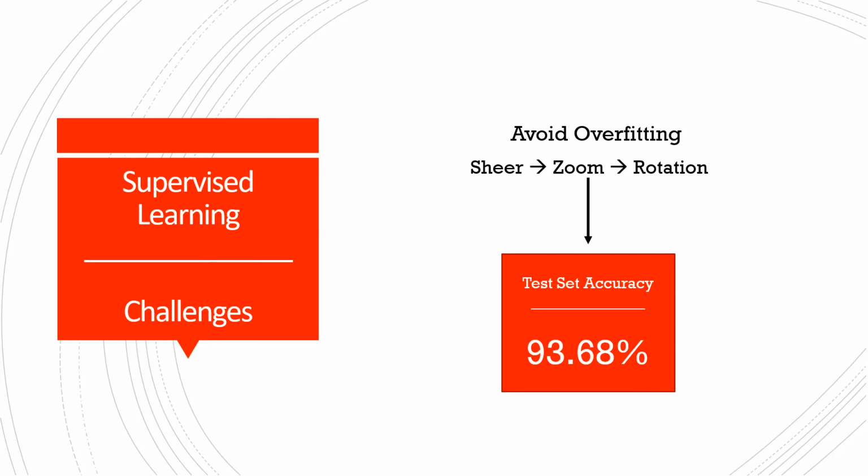We also attempted to use the ResNet 50 architecture. Unfortunately, it did not work as we anticipated. Training took a long time, and the model was quite inaccurate as well. Afterwards, we added a random zoom, and that pushed the model's accuracy to 93.68%. Overall, 93.68% is very good for a model that's training on a dataset of lung CT scans.